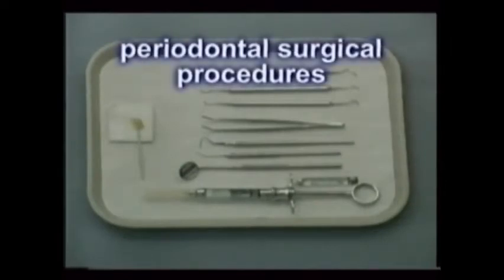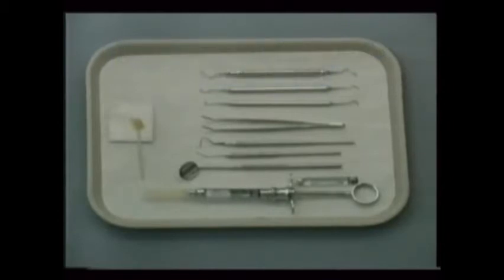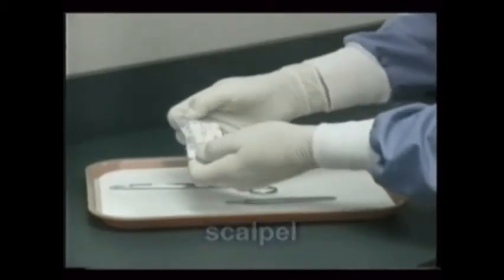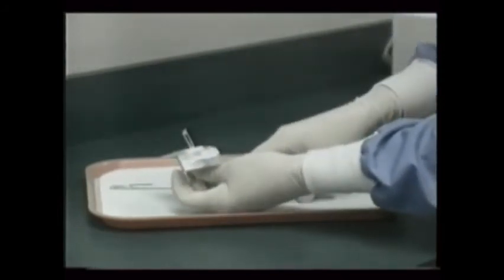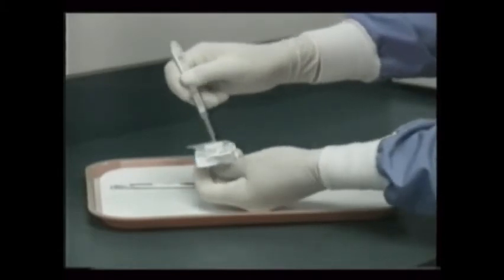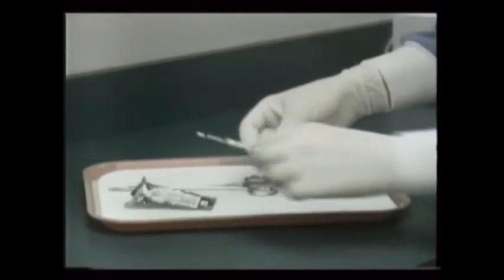Periodontal surgery uses a variety of unique and unusual instruments. All of the items gathered for non-surgical care are included in the surgical setup: the anesthetics, scalers, curettes, the ultrasonic cleaner, and others. Because of periodontal surgery's inherent greater bloodiness, patients often are draped more extensively, and you may do this with surgical towels. Additional instruments needed, in the approximate order of use, are the scalpel handles and blades, which are seen being assembled here, and the periosteal elevator. These are used collectively to reflect the gingiva and to allow access to the underlying bone.